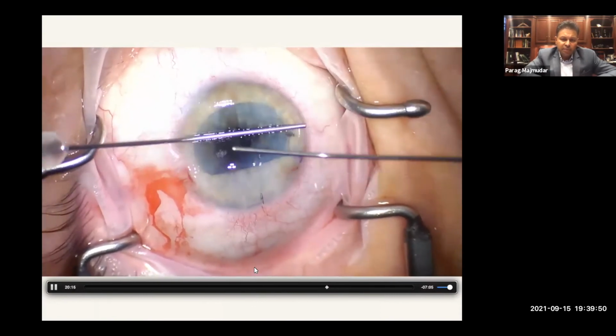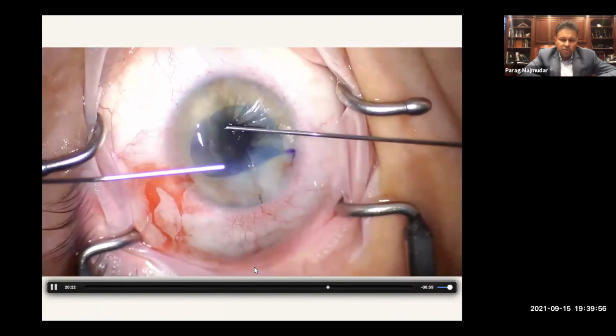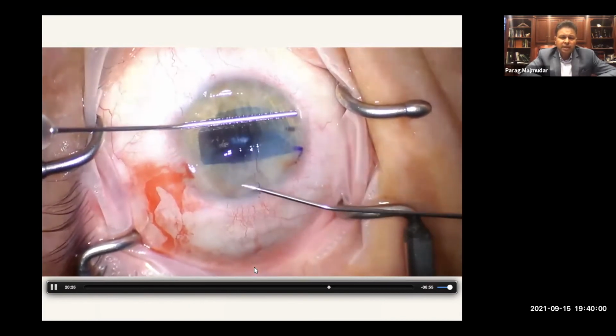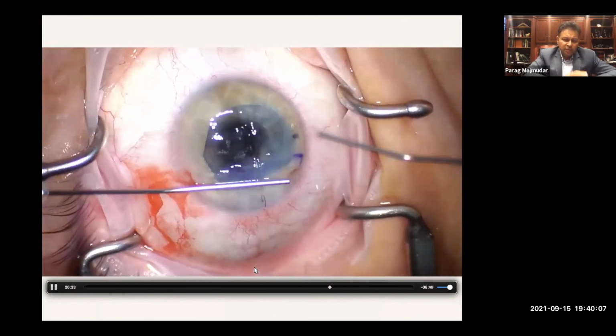And then I'm just tapping on the eye, tapping. This one doesn't want to go very smoothly, but it'll get there. Just be patient and it'll work. I like this 2 cannula technique because it really kind of holds the graft in position, and you can use it to sometimes just really stretch that out there and really flatten it out.